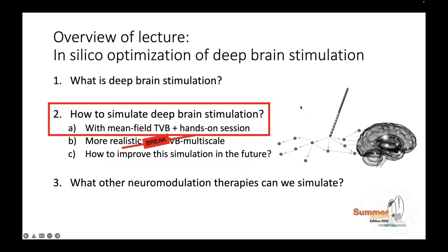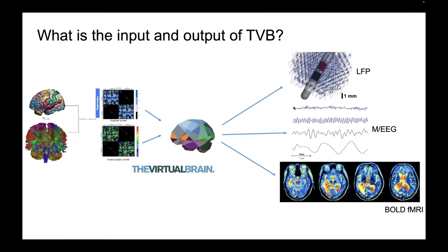So we imagine that the high performance cluster power that we have, for example, with eBrains, can be used to just try out the different settings together with some machine learning, where we find the optimal solution quite fast and can see, okay, now we have the happy patient and we have the right medication, the right settings for the electrode for each individual.